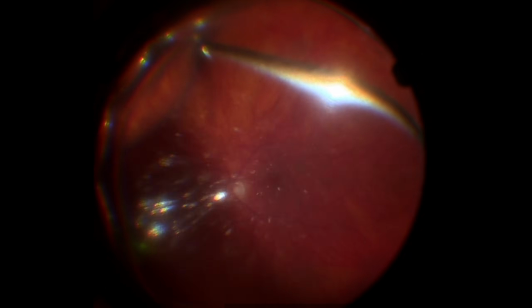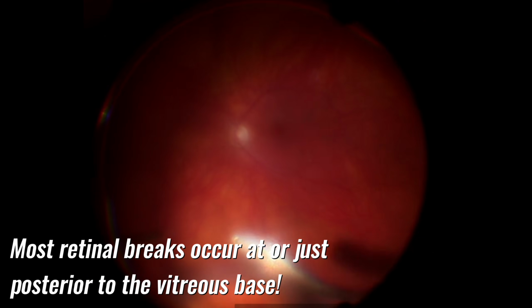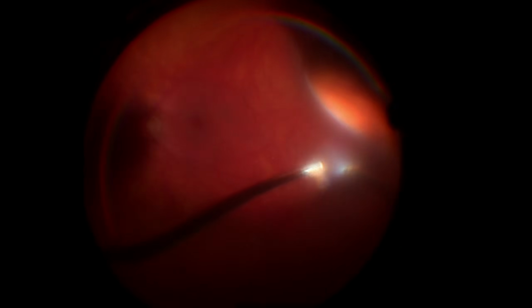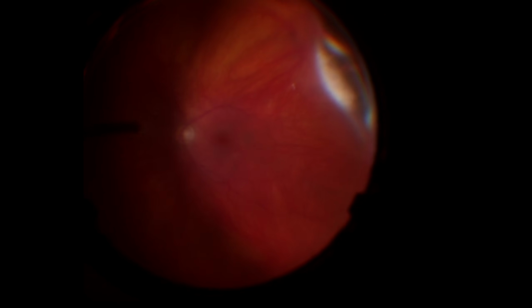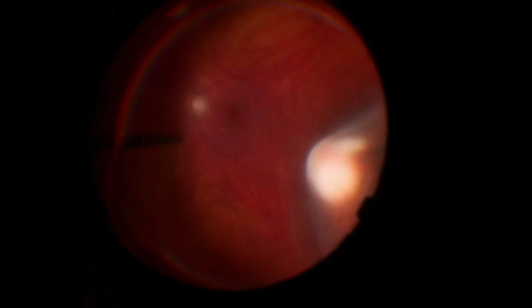One strategy for a localized detachment without a detectable break is to treat the entire affected quadrant with cryopexy or sectoral endolaser of peripheral retina at the vitreous base, where most breaks occur. This creates a strong chorioretinal adhesion and can effectively seal an undetected microbreak. Another approach follows the same principle, placing a segmental or encircling scleral buckle to support the vitreous base and potentially close the break that led to the retinal detachment.